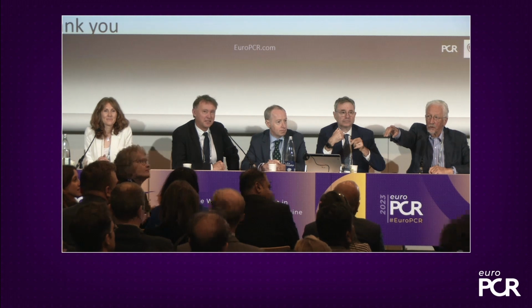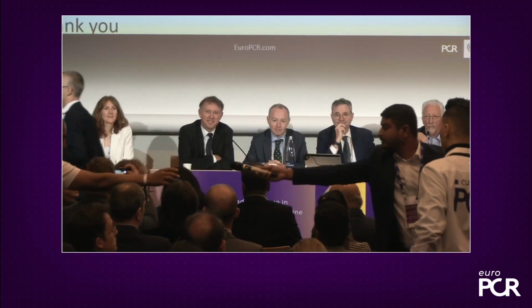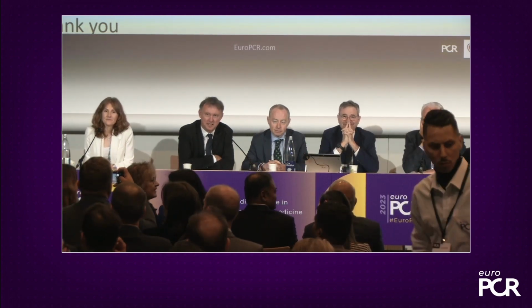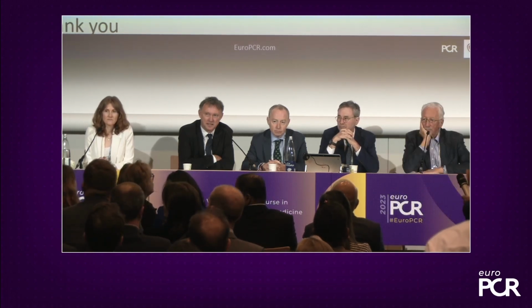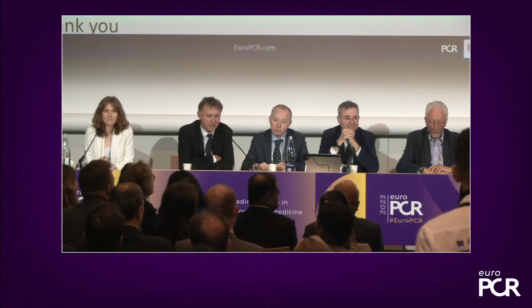We have a question for the gentleman here, if we can give him a microphone. Very impressive. Thank you very much. Just one question: will you ever consider using the drug-coated balloon twice, or just once? I can't answer for every single balloon that's out there on the market, but the vast majority of them, it's a one-off delivery. Certainly, this one is a one-off delivery.